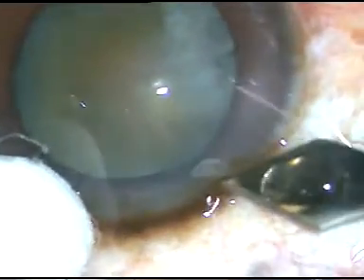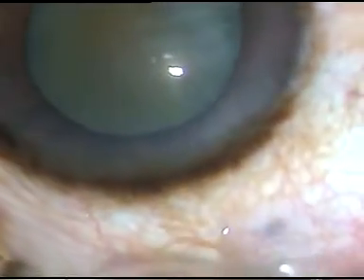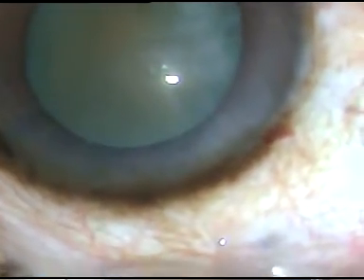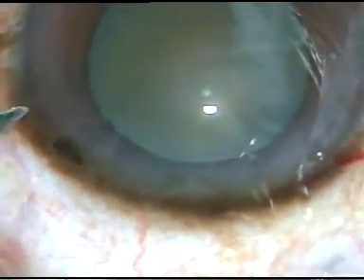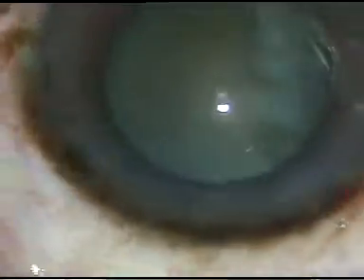Dear colleagues, this is a non-intumescent white cataract. A 2.8 mm main incision is made at a desired site, and 3 o'clock hours away, on the left side, a paracentesis incision is made.